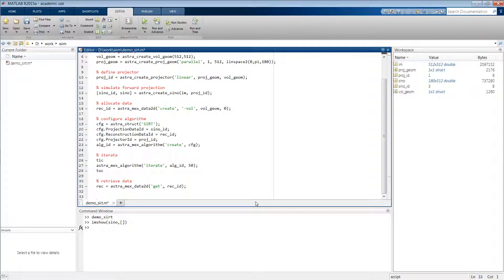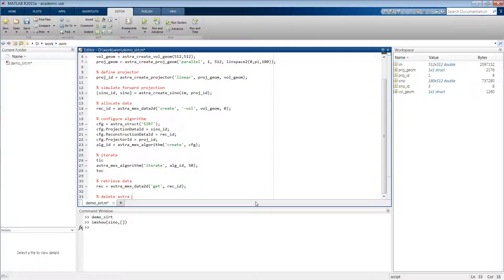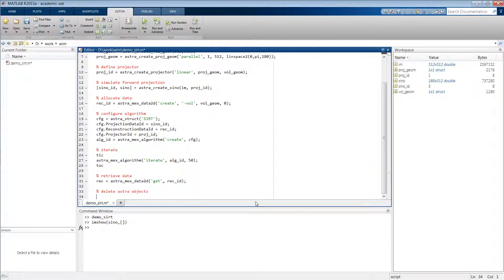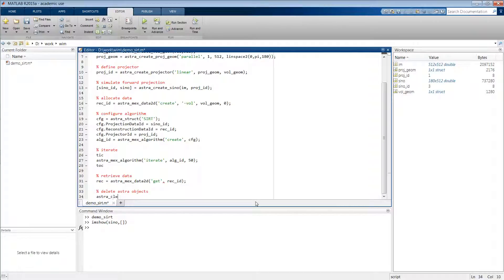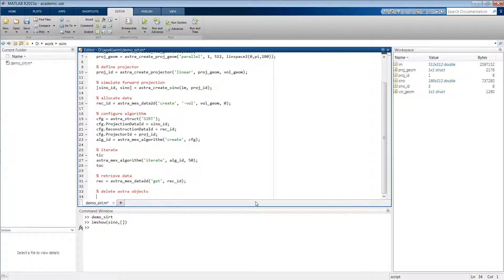And then finally we still have to delete all ASTRA objects. We can do this easily by typing astra_clear, which deletes all objects that are linked to the ASTRA toolbox in the memory. But you can also do this object by object, which I'll demonstrate now.